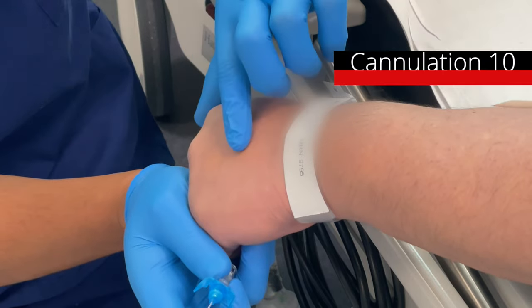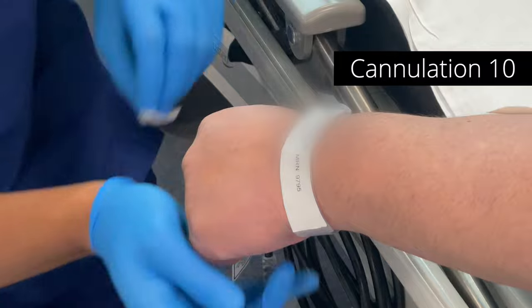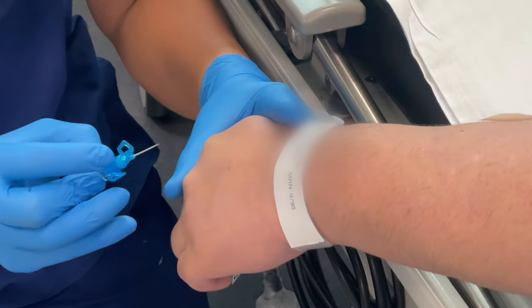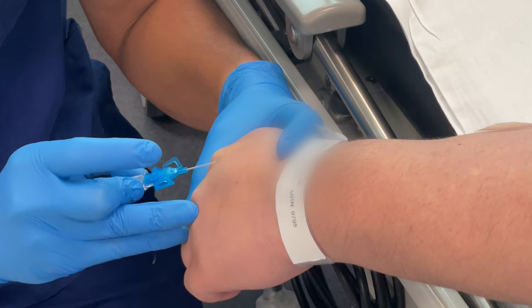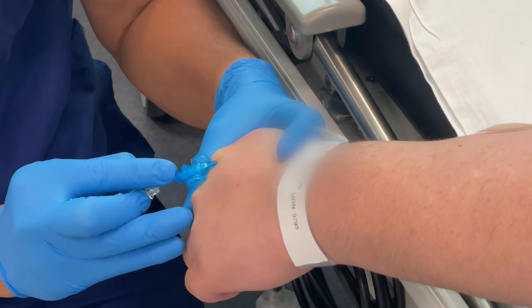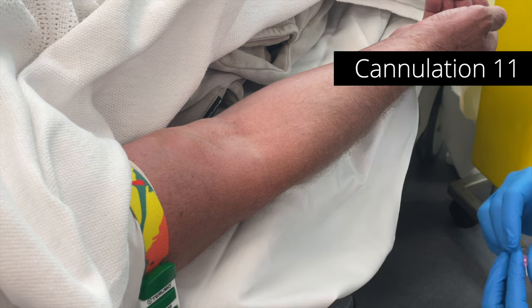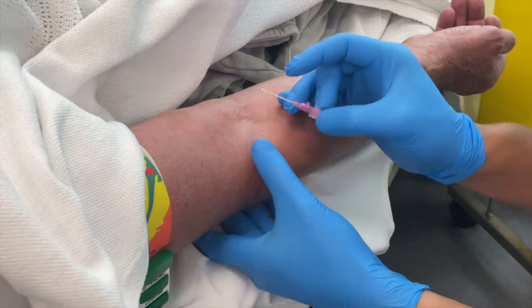This cannula I'm palpating just over the knuckle, which isn't the ideal position — if the cannula is over the knuckle it's more prone to trauma and getting caught on things. But again, for a short case it's completely reasonable, and this patient had very few options for cannulation. Sometimes you just have to get the best vein possible, even though it's not the perfect vein. Here's a cubital fossa vein and I'm using one of my favorite cannulas, the B. Braun Intracan Safety Cannula.